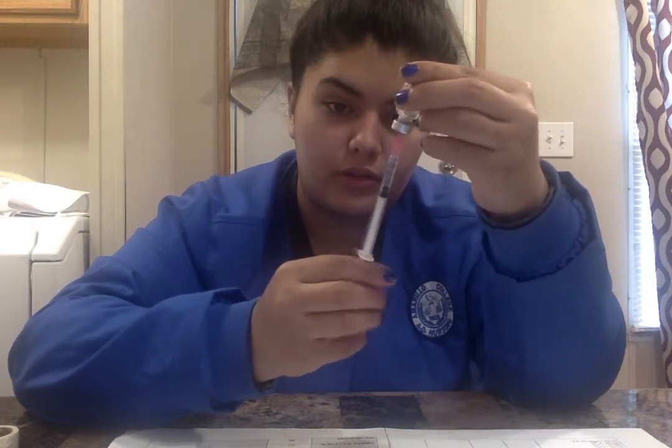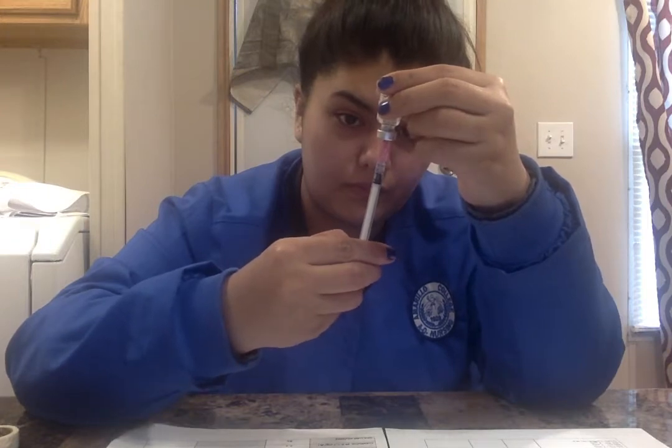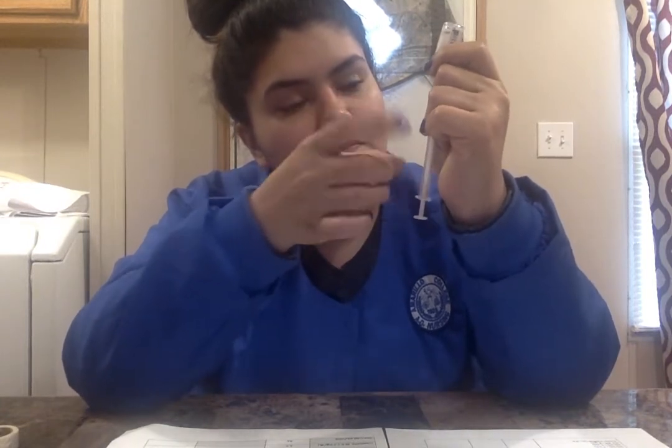And then we're going to make sure that there's no air bubbles. And I see an air bubble, so I'm going to go ahead and get that out of there. Okay, and it's out.